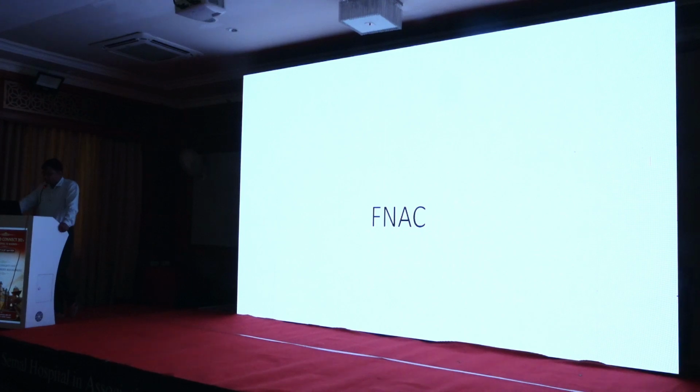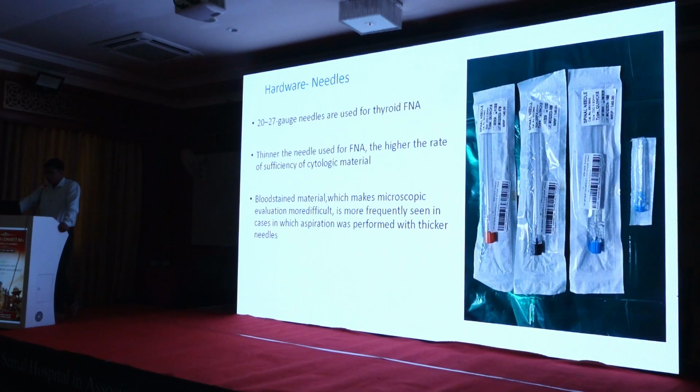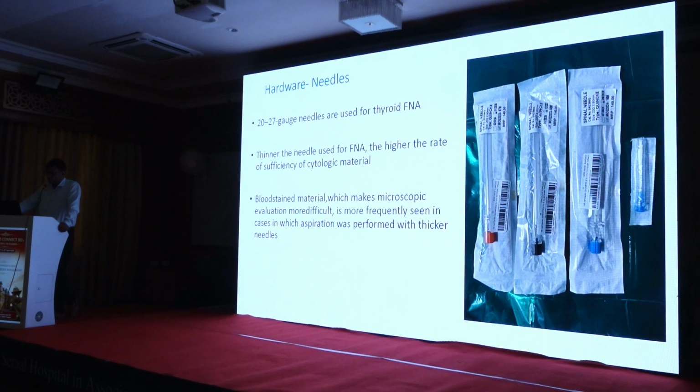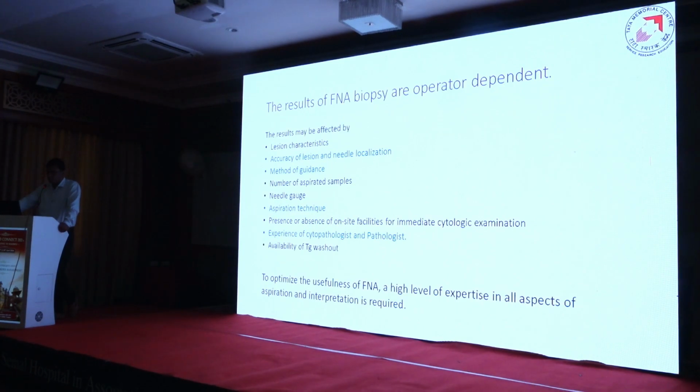Coming to the FNAC, it is actually an important part of the diagnostic algorithm, and we should know the hardware. We are using spinal needles most of the time, and if the lesion is accessible with a smaller needle, we will use that with the syringes. The results of FNA are very, very operator dependent, including whether we are characterizing and targeting the true lesion itself.